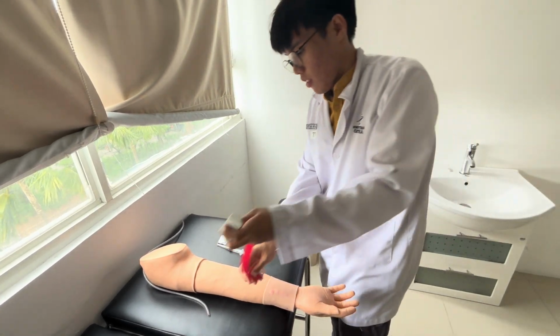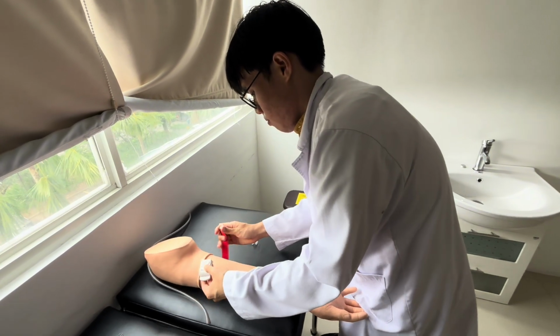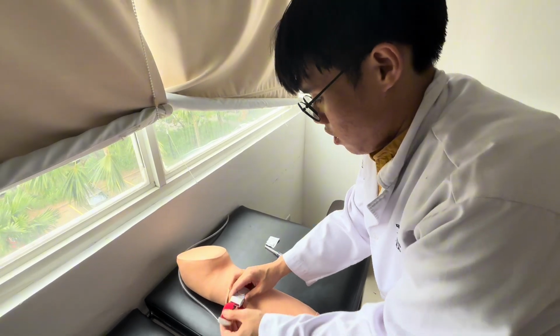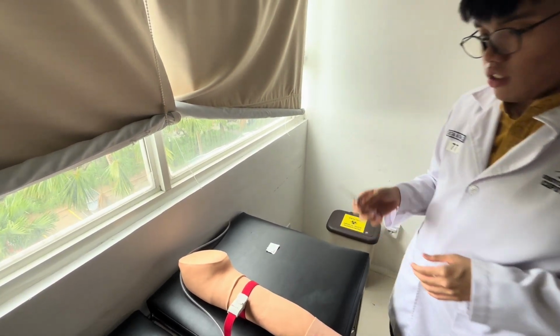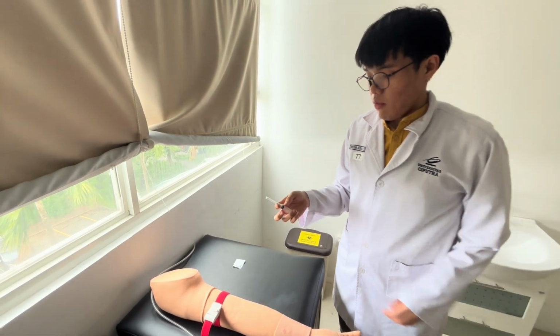I will apply it proximal to where I will administer the injection, approximately. So make sure it's tight, but not too tight. But there's the syringe, so I will make sure.